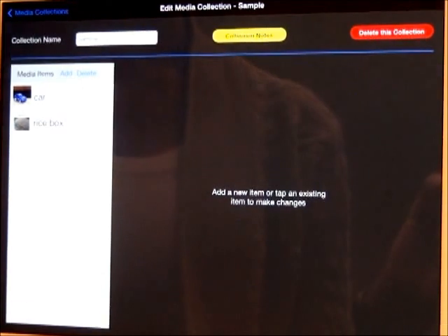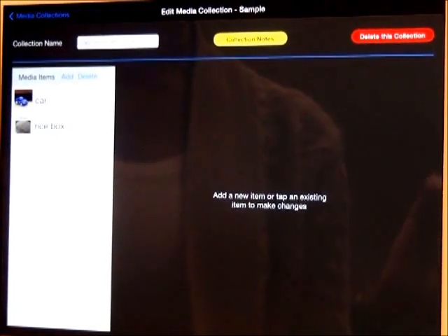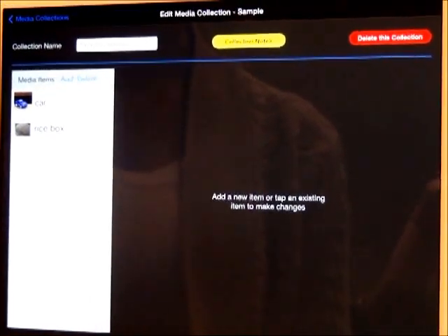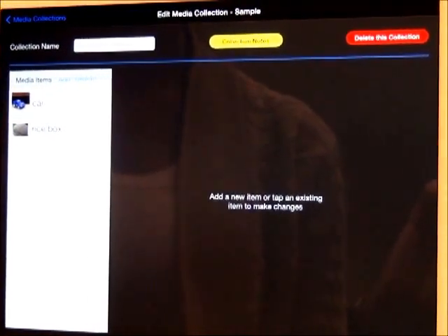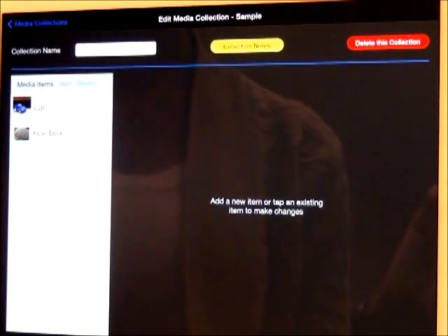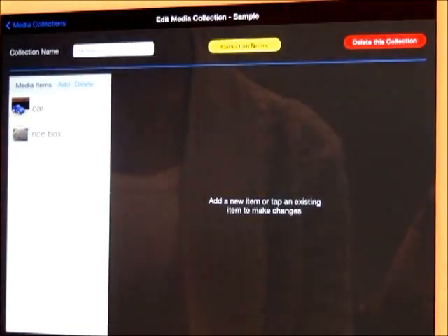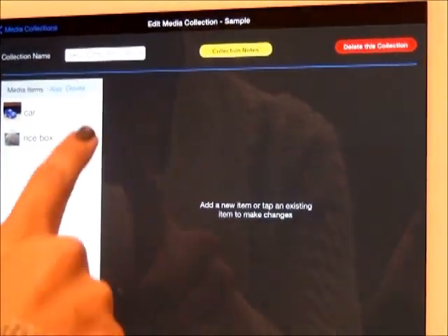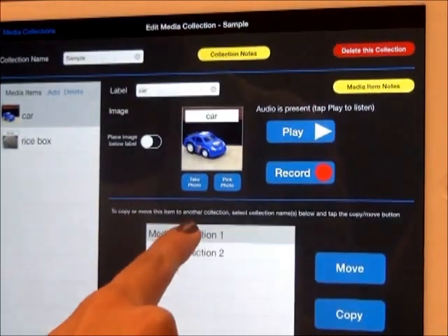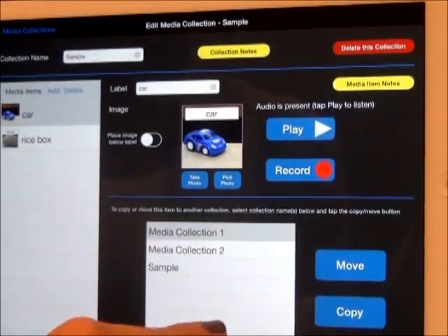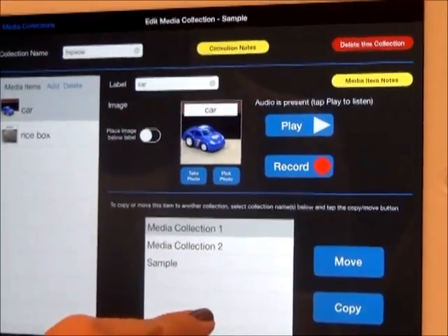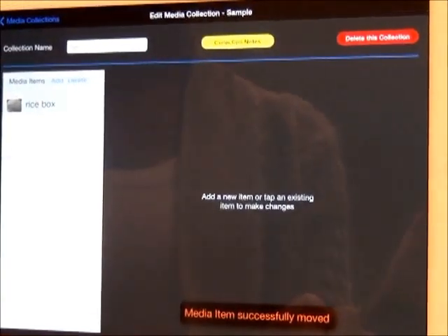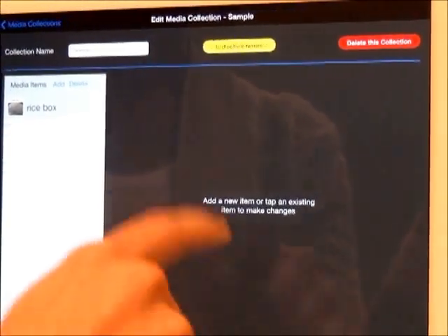Once you have finished adding symbols, you may move and copy symbols from one media collection to another. Highlight the symbol you want to copy and then the media collection you wish to copy it to. Hit Move or Copy and double check that the symbol has been transferred.